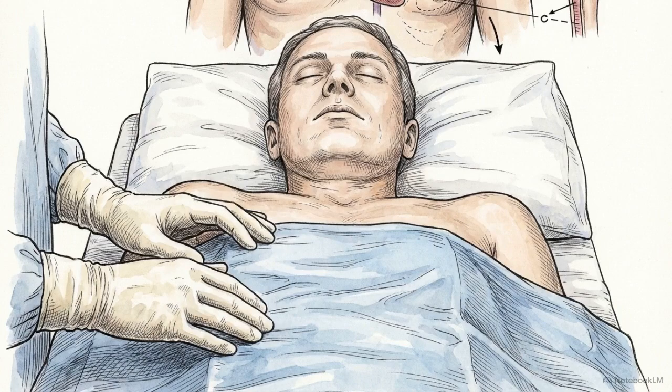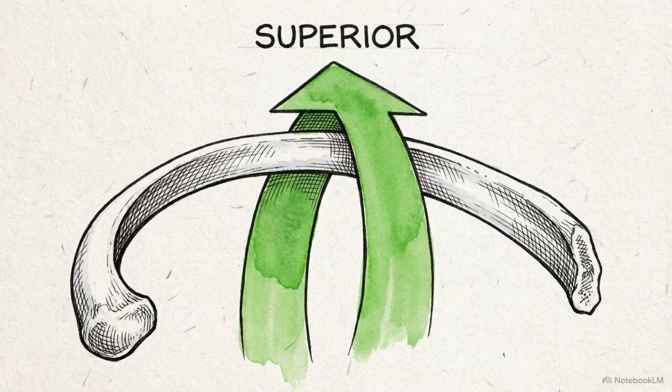Meticulous, layered anesthesia along this specific trajectory provides the foundation for patient compliance during the highly physical dissection phase that follows. Step 3 is blunt dissection.